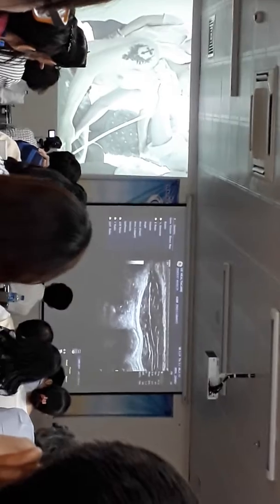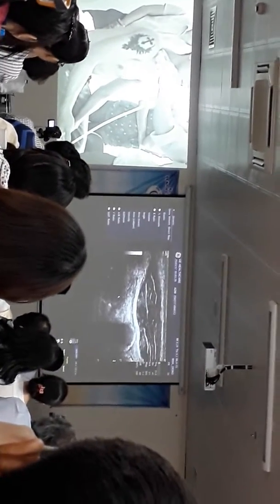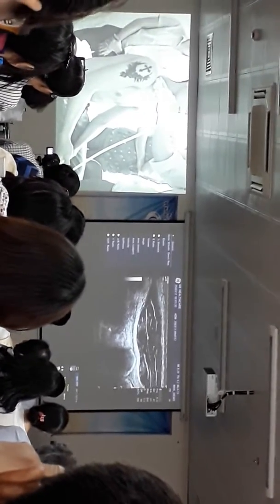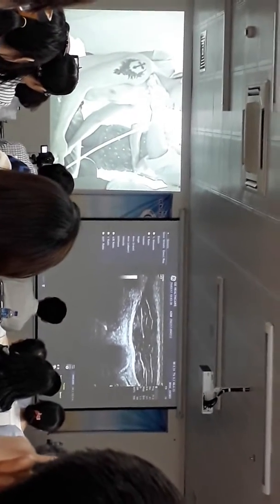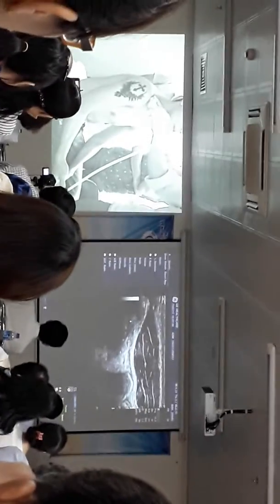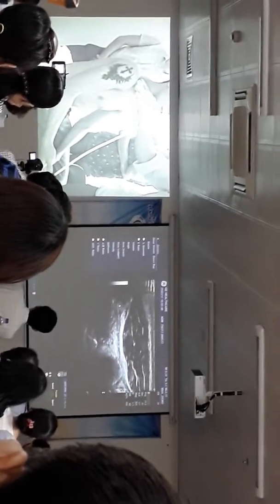So if we go up just a little bit and then rotate the probe counterclockwise, sau đó chúng ta xoay cái đầu dò, we can see from the coracoid process, this here is the proximal part of the coracohumeral ligament. Mình xoay đầu dò vào cái vùng ngay chỗ mỏm quạ và xoay theo hướng ngang để khảo sát cái dây chằng quạ cánh tay. And that is forming the roof of the rotator interval. Dây chằng quạ cánh tay là mái của cái khoảng trống cơ xoay.